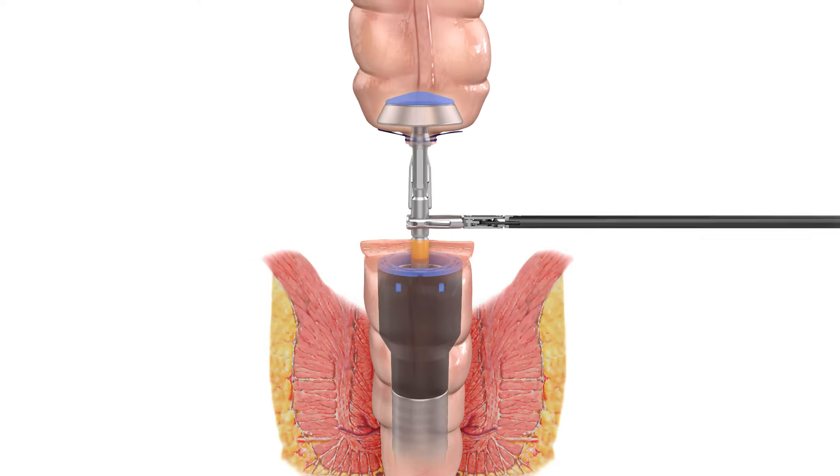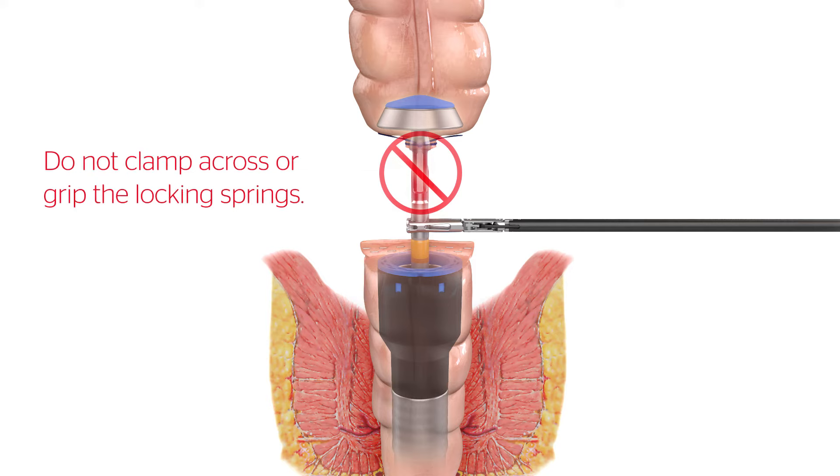Attach the anvil to the extended trocar. Do not clamp across or grip the locking springs when attempting to reattach the anvil.